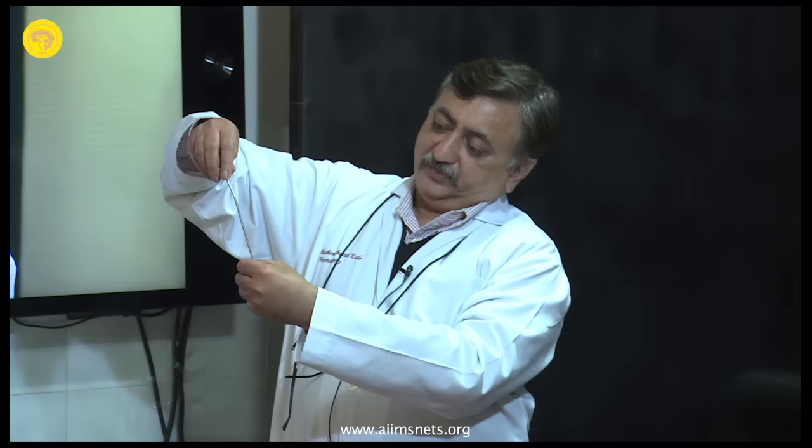Can you see the tip? It's got a round ball, so it won't hurt anything. You scrape the walls all around and make sure that your bone is intact all around. Then you're sure that, okay, you're inside the pedicle, you've gone into the body without breaching any of the cortical bone. And once you have made sure, put the screw in.